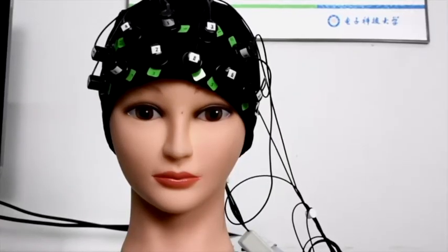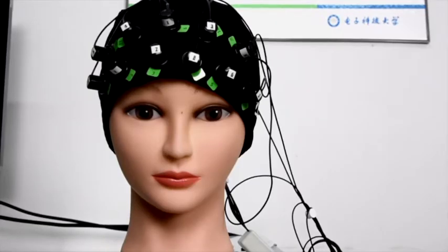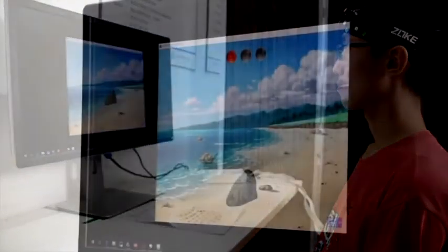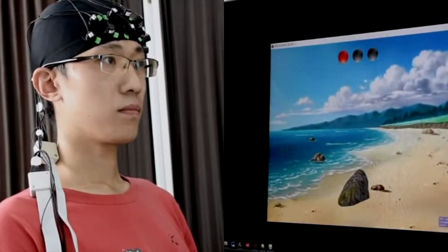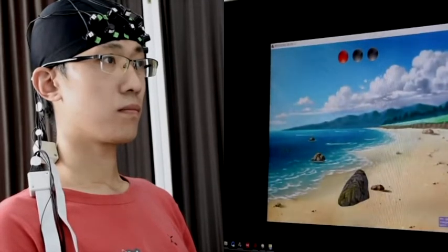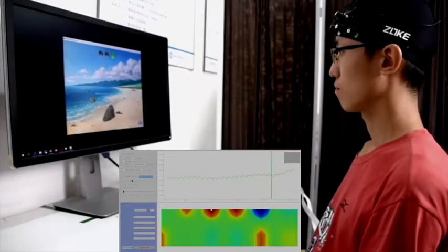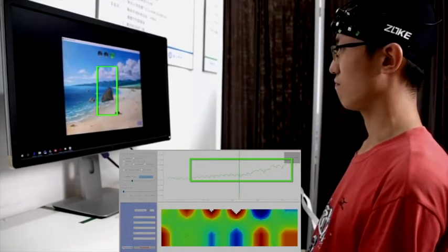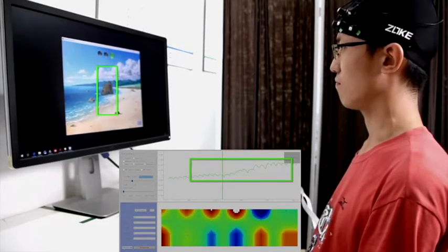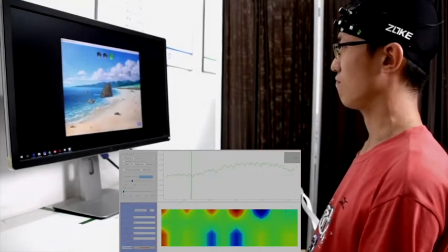We choose orbital frontal cortex as region of interest and want to find out whether subjects can learn to upregulate their OFC activity. We choose a stone as feedback signal to motivate subjects. There are three lights on the top. At the beginning, the red light is on, which instructs the subject to rest. After that, the light switches to green, which instructs the subject to focus on the stone and try to lift it as high as possible by using their mind. The stone reflects activity in the OFC. The stronger the activity, the higher the stone.